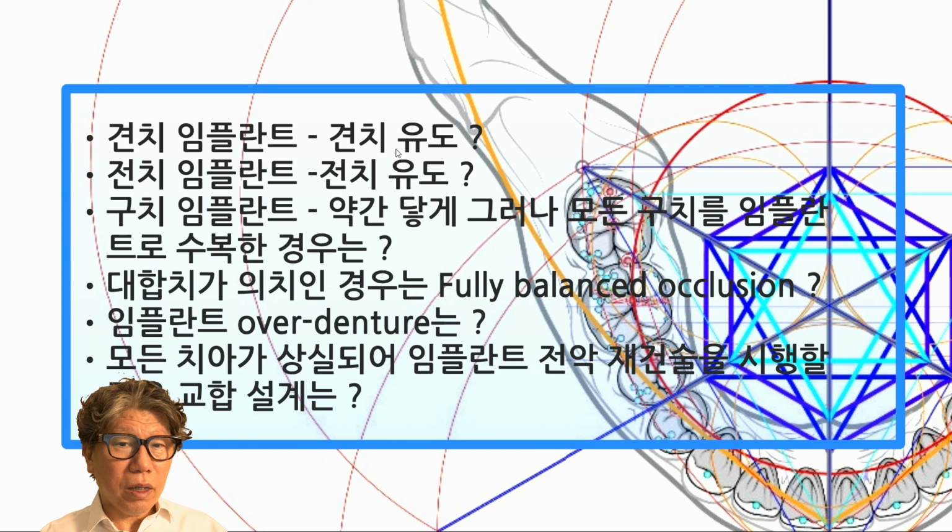Let's examine the content with this concept in mind. Upon consideration, in centric relation earlier, the centric occlusion of the molars protected the anterior, and in eccentric relation, the guidance of the anterior teeth elevated the molars. By inducing disclusion, a mutually protective occlusion is established. This is how it was expressed, and to explain it goes like this. If natural teeth are in good condition, in fact implants can be slightly underused. They can make less contact. If the occlusal support of natural teeth is good, natural teeth protect the implants. Also, if there are many natural teeth, implants can be made to contact slightly less than the natural teeth. So, the occlusion is set up to allow natural teeth to protect the implants, and conversely, in situations where there are many implants, or the support of the implant is good, occlusion is formed primarily around the implants. This allows natural teeth to slightly avoid contact.